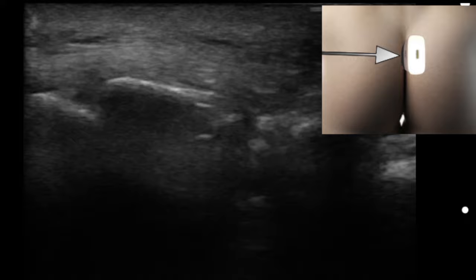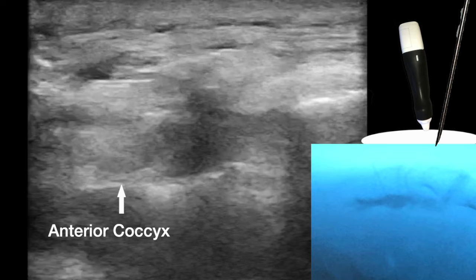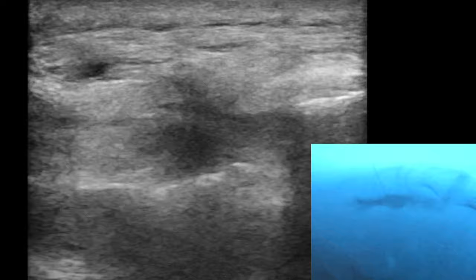By tilting the ultrasound, one can visualize the anterior coccyx clearly and visualize injectate spread. Injectate spread immediately anterior to the coccyx should avoid rectal spread.